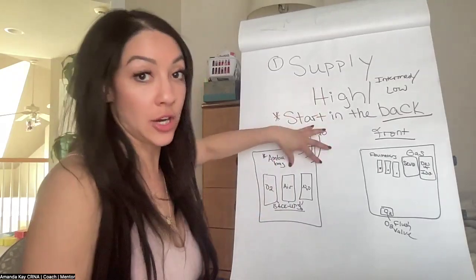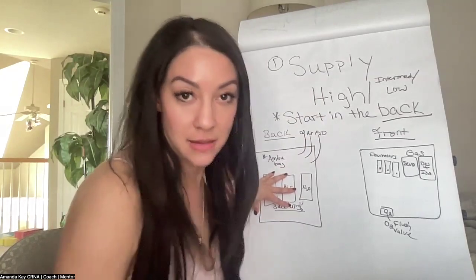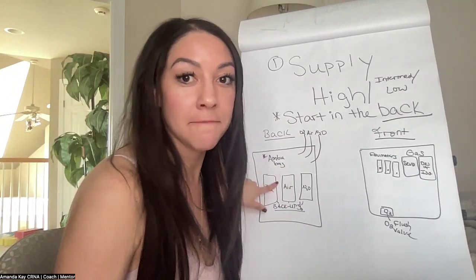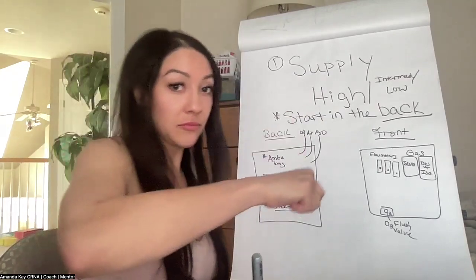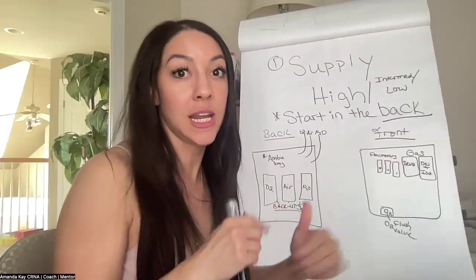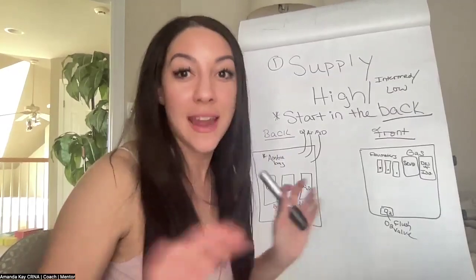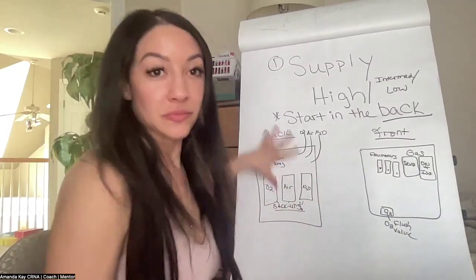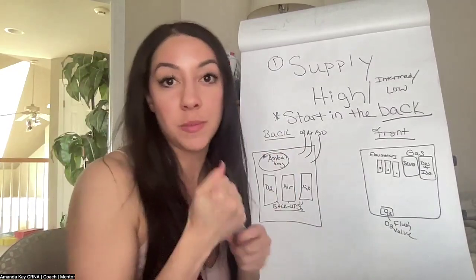So you check your pipeline pressures, and then you always, always, always check your backup tanks. Because if something happens, God forbid, and you don't have any oxygen in here, you're going to be scrambling. So always make sure. Usually they have a little key, you spin it, and then you're able to read the PSI in the front of your machine and make sure they are not empty. Cannot stress that enough. It'll save your little butt. Never skip that step. Never skip that step when you're doing that. So this is part of the back of the machine, and a little side thing: you should always make sure that you have an Ambu bag back there as well.